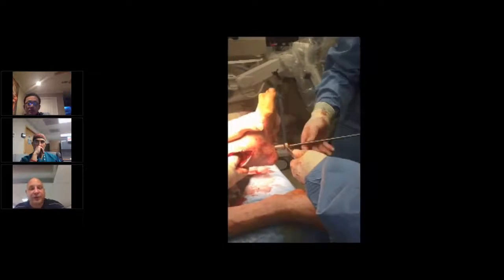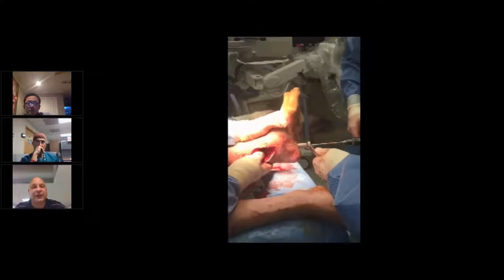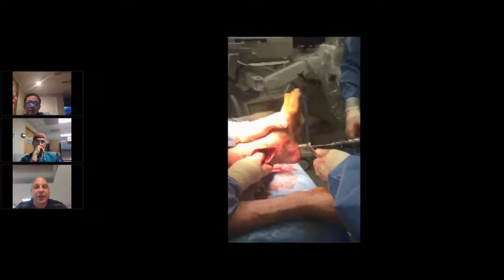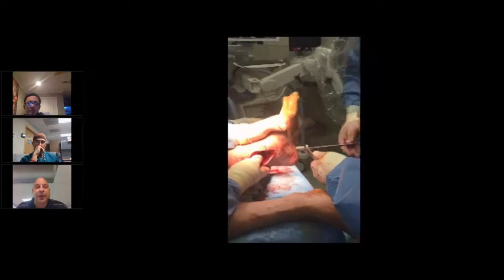So this is just a quick video showing what we did. Pretty much all the dissection is done. The bone graft that we took has been sized and placed inside the ankle joint region, and then we pretty much ream as if we're putting the IM nail in.